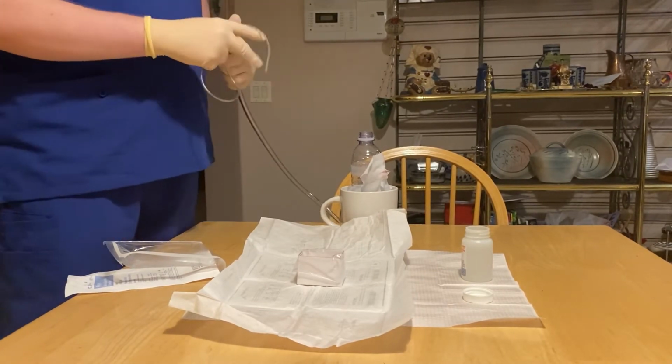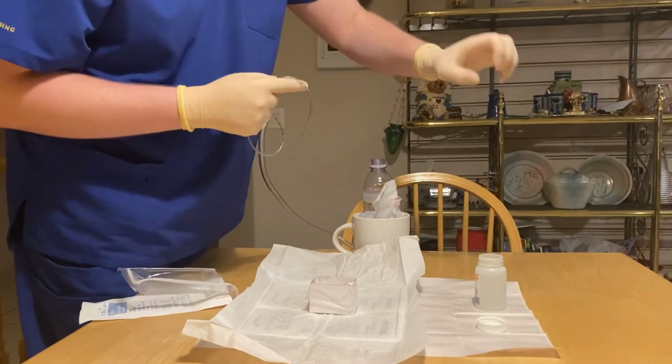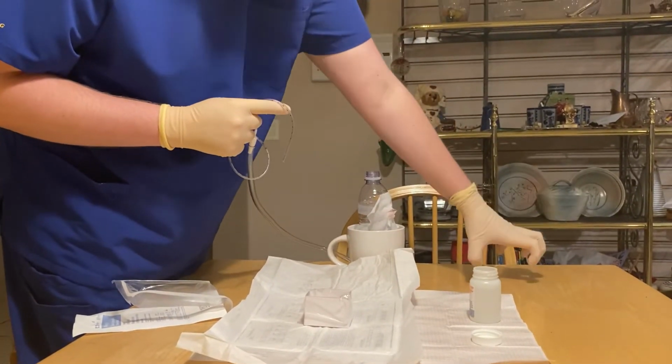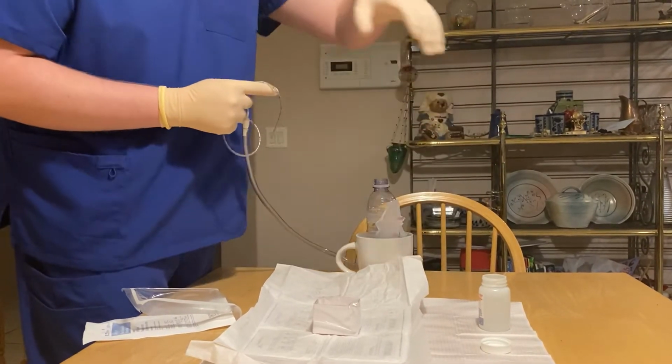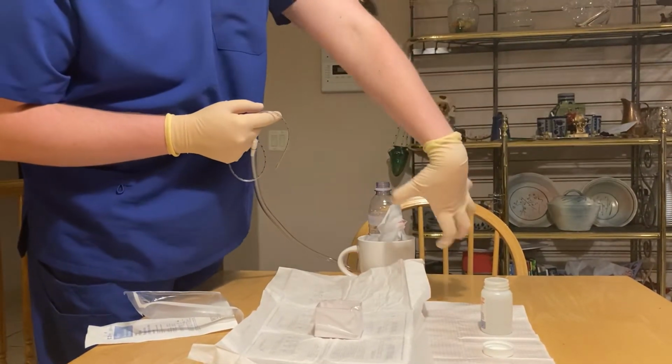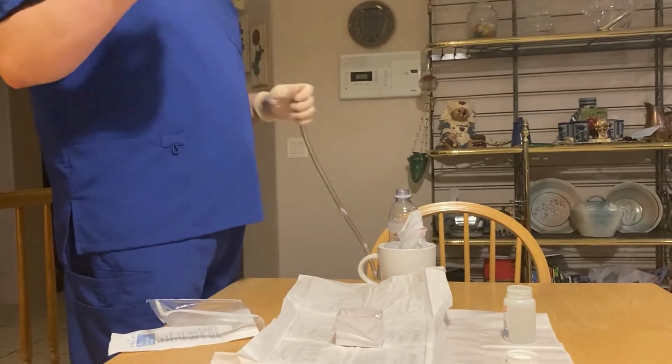And then before I do anything else, I would take the ambu bag and give him a couple more breaths. I removed the mask earlier, so I would now put the mask back on so he can breathe, and then I would start cleaning up.